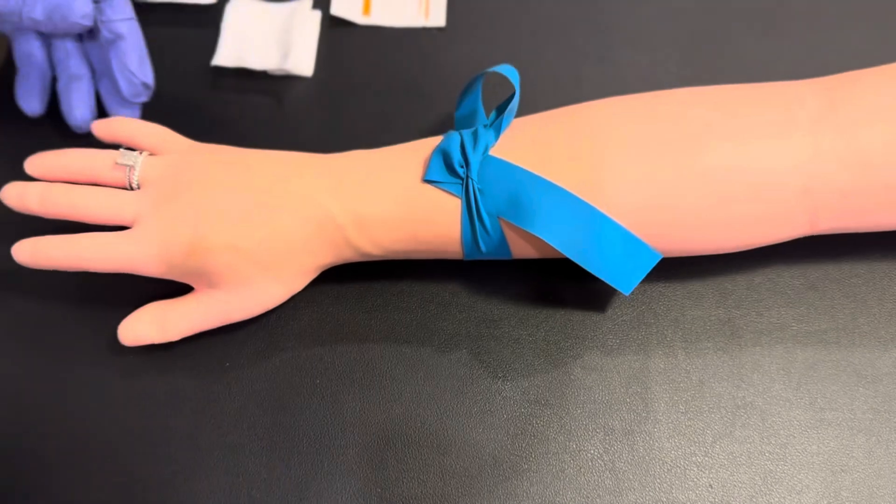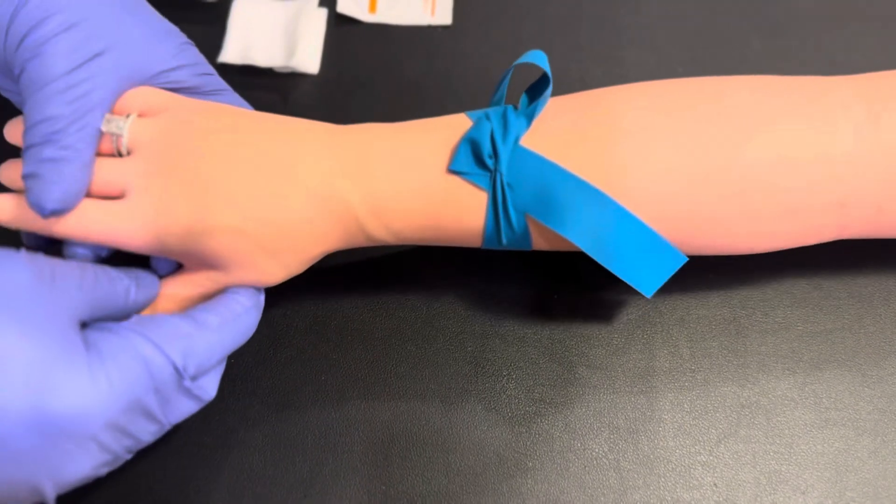First, apply the tourniquet three to four inches above the venipuncture site.